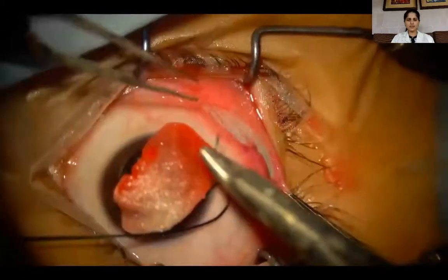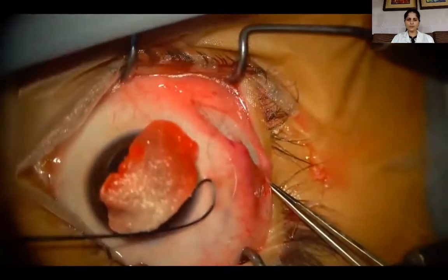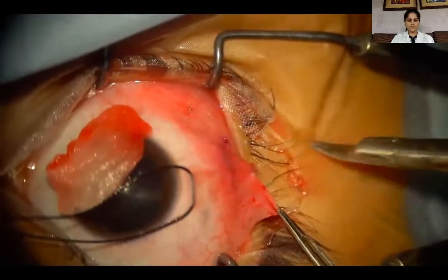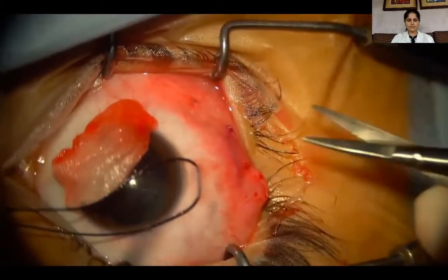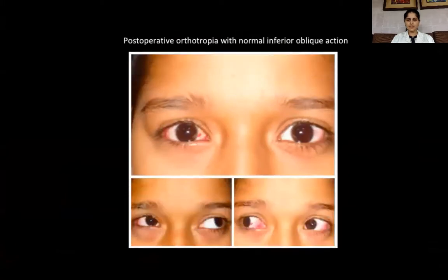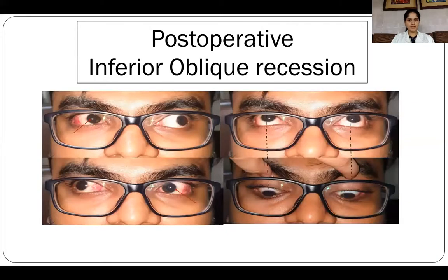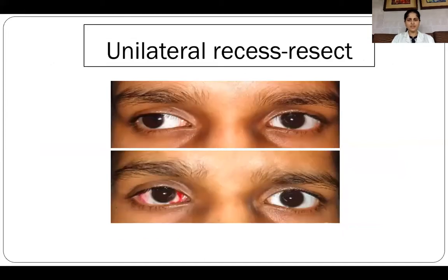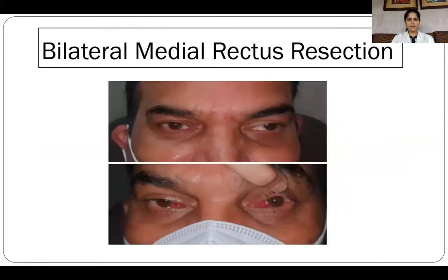The conjunctiva is then closed with 8-0 polyglactin sutures or with glue. Inferior oblique weakening procedures do not affect the horizontal deviation and give good results post-operatively. This procedure reduces the inferior oblique overaction and collapses the V pattern. This technique can be combined with bilateral lateral rectus recession, unilateral recess-resect procedures, and bimedial resections.